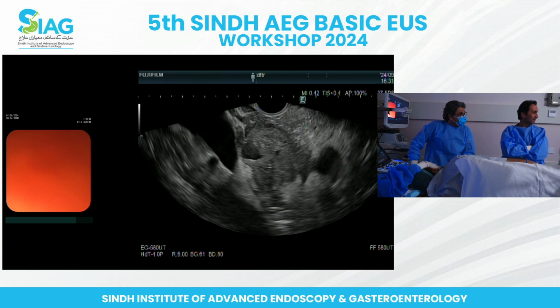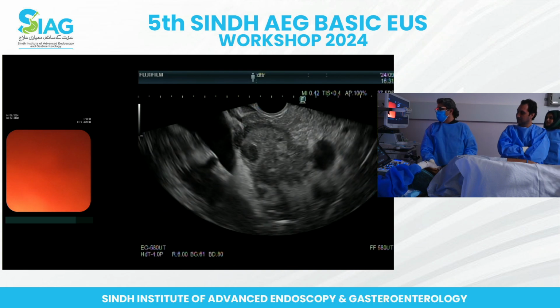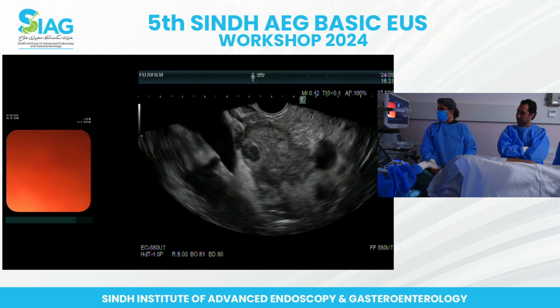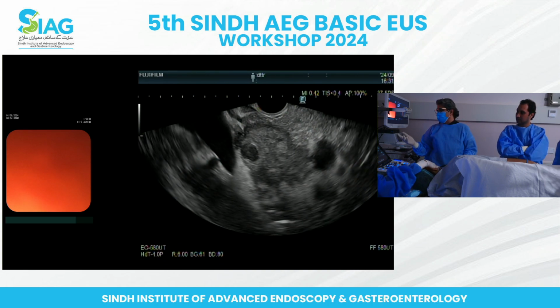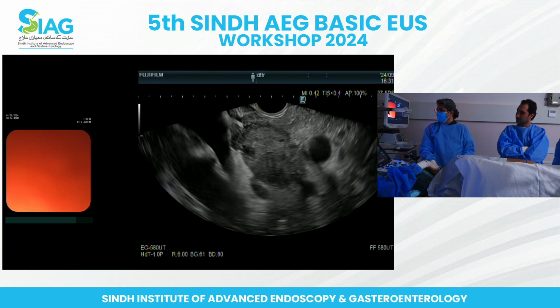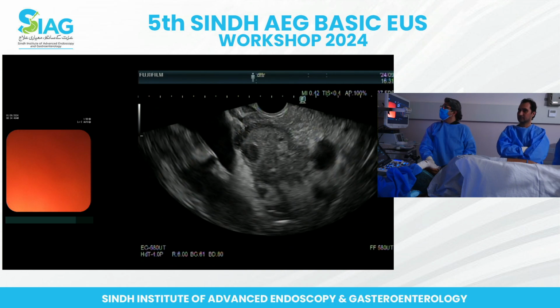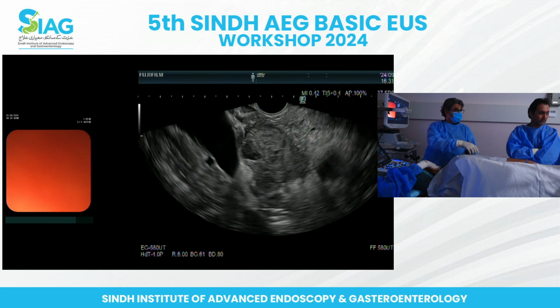You got the cells? Very nice. So we've got good core, we've got good cells. I'm quite comfortable with one pass. We got a good core. Anybody in the audience want us to try again? Yeah, I think if you're comfortable, that's good enough. Good. Fine. Yeah. I will do it.